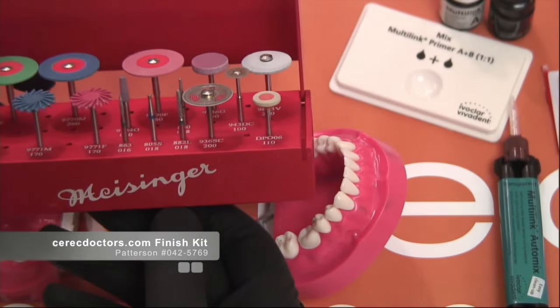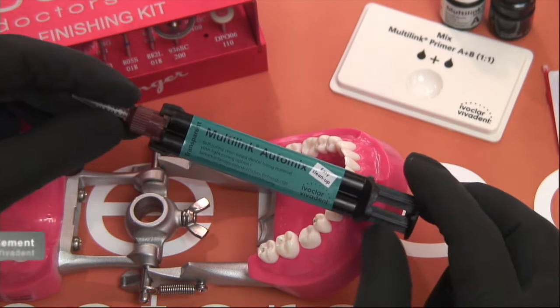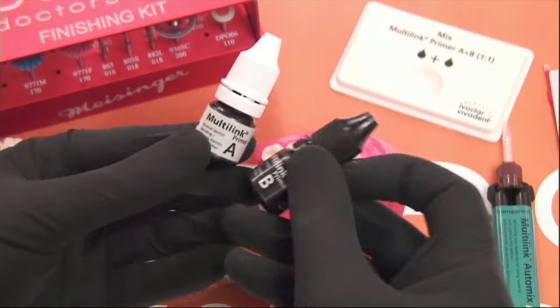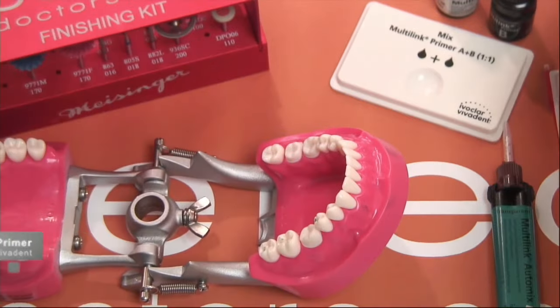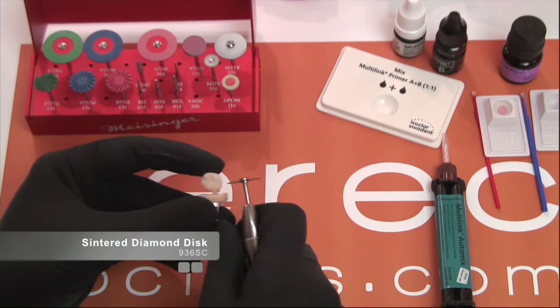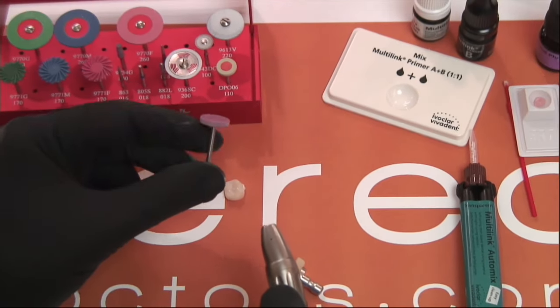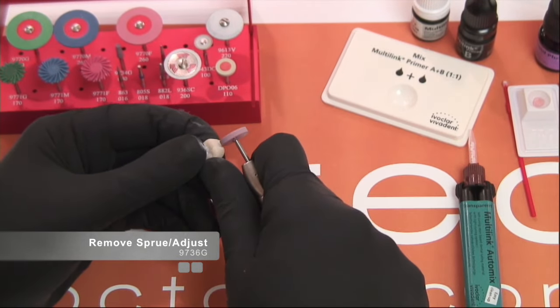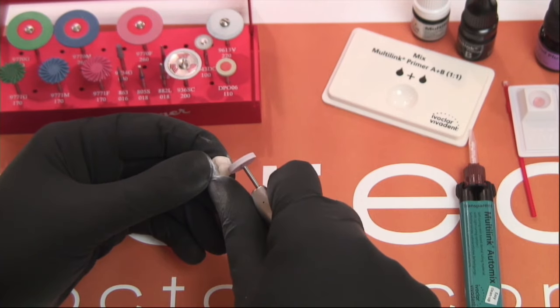We've already milled the Vita Enamic, and now we're going to talk about polishing and removing the sprue using the Meisinger kit, and how to cement the material using multi-link. The first thing we're going to do is cut off the sprue using a disc, then go to the stone wheel — burr 9736 in the kit — which is used at low speed and moderate pressure to remove and smooth out where the sprue was.